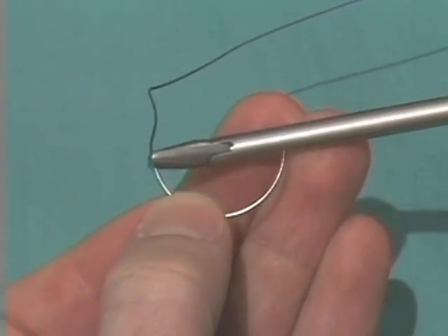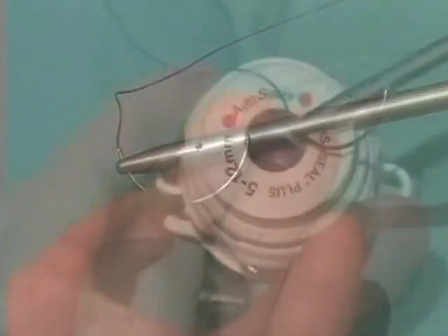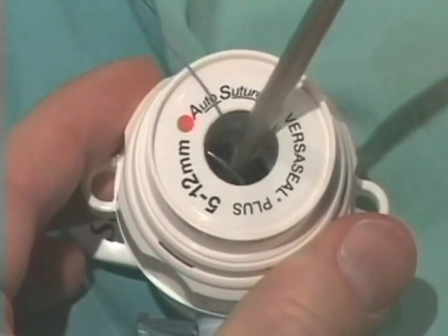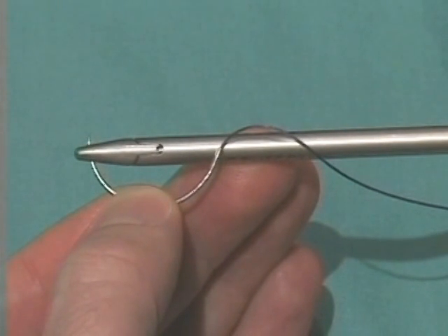A second technique begins with a needle driver in the surgeon's non-dominant hand. Grasp the heel of the needle with the tip of the driver and place the point of the needle alongside the driver as shown. The needle is then placed into the abdomen where it can be easily grasped with another needle driver. This technique can also be used with an assistant introducing the needle from the other side of the patient — simply reverse the positioning of the needle prior to insertion into the abdomen.